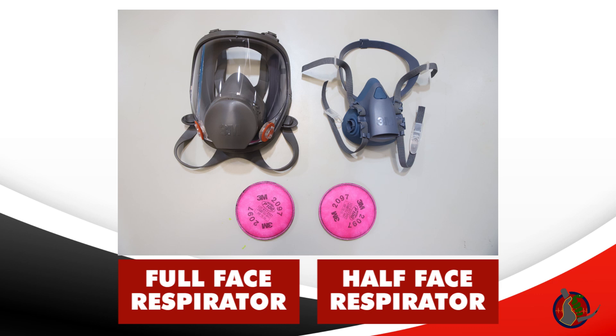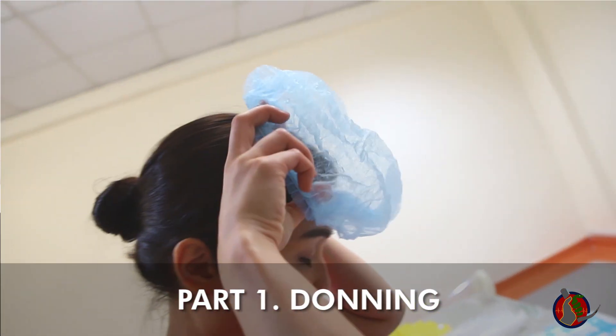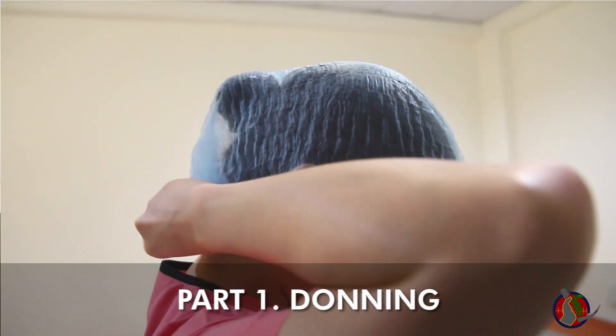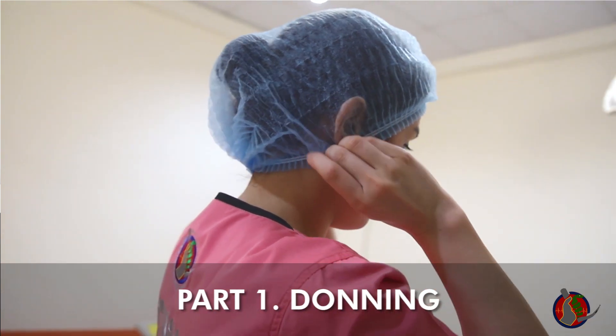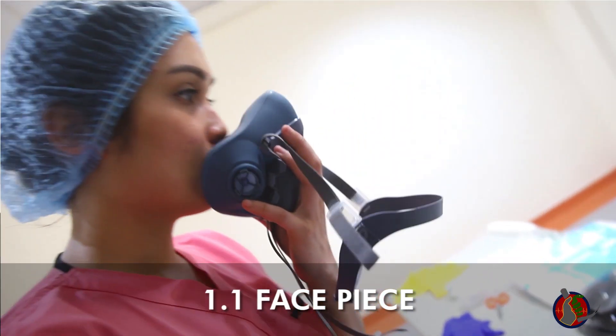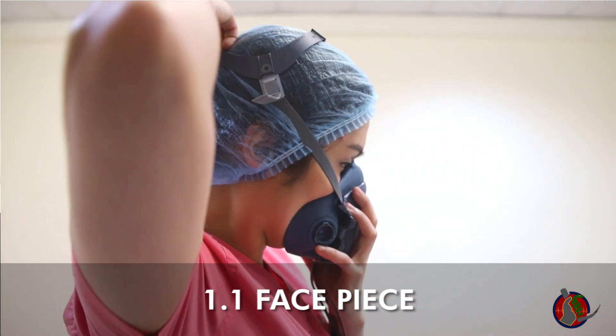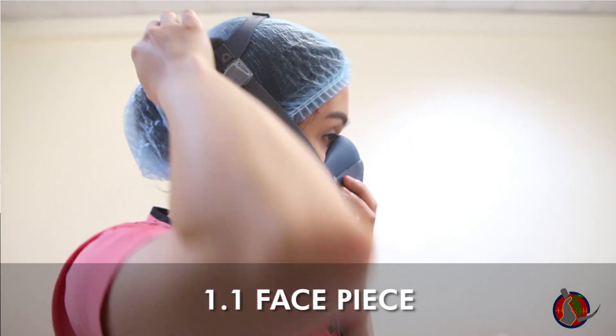or gases by using filters. There are half-face and full-face respirators. The respirator is the second item donned after donning the head cap, and in lieu of the N95 mask. With your dominant hand, grab the mask by its expiratory port and position the mask against your face. With the other hand, pull the upper straps around your head.